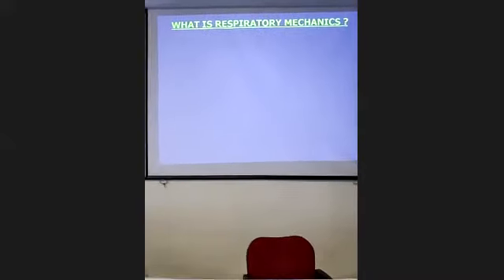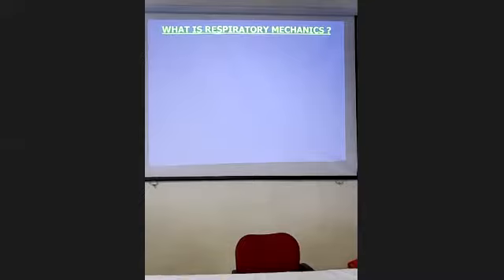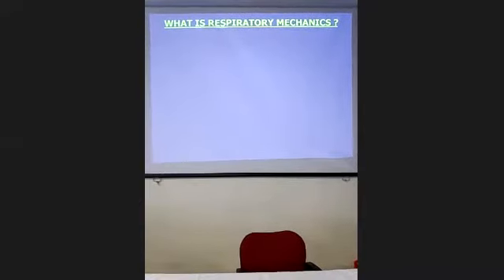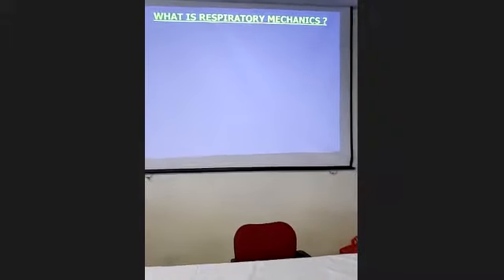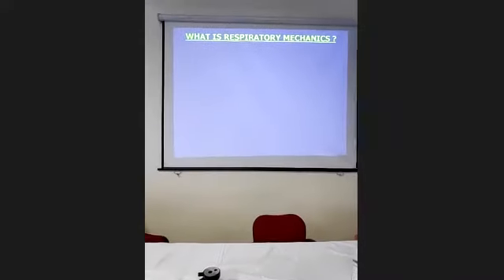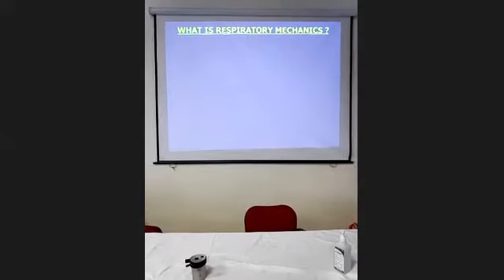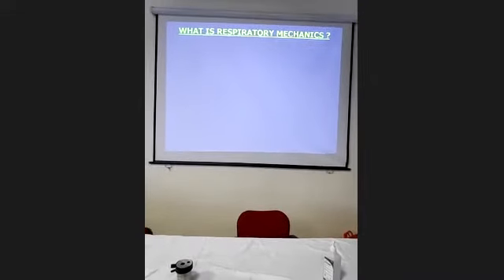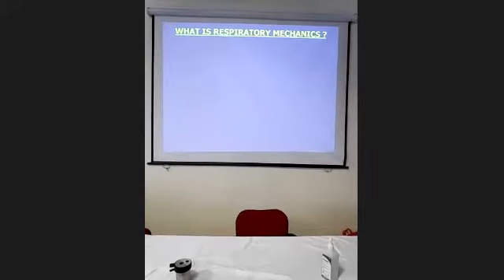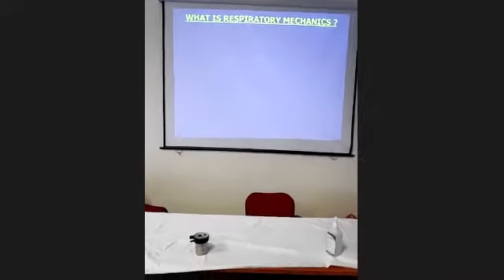Okay. Now, the next question is, what is respiratory mechanics? As I said in the beginning, if you are using a mechanical ventilator, you have to understand the respiratory mechanics of a patient, because these mechanics are going to get changed with the mechanics of the ventilation. So if the mechanics of ventilation synchronizes with the mechanics of the lung, then only the patient is going to be comfortable. If the mechanics of the patient differ from the mechanics of ventilation, then definitely it is going to harm the patient. So we have to understand the mechanics of the lung also.